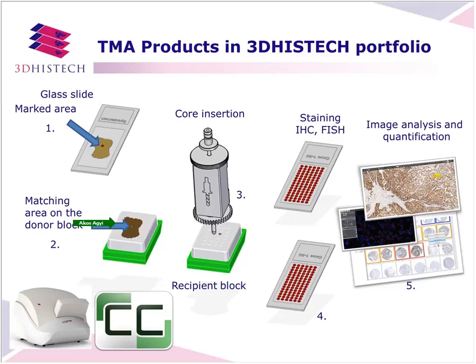The digital slides could be opened from a local hard drive or from our CaseCenter server application. At the end of this workflow, you can use our image analysis software to analyze your TMA slide. For example, you can use the TMA module for manual scoring, or you can use our quantification software for immunohistochemical stainings or for FISH quantification.